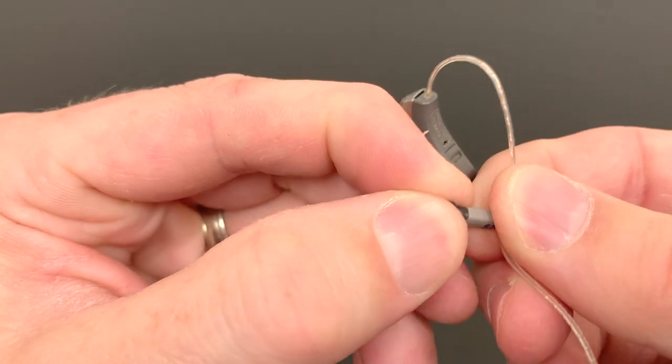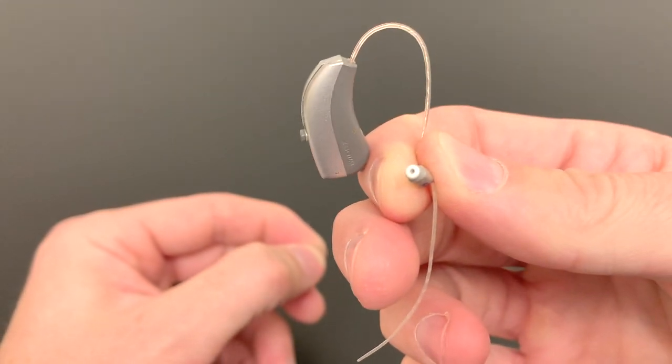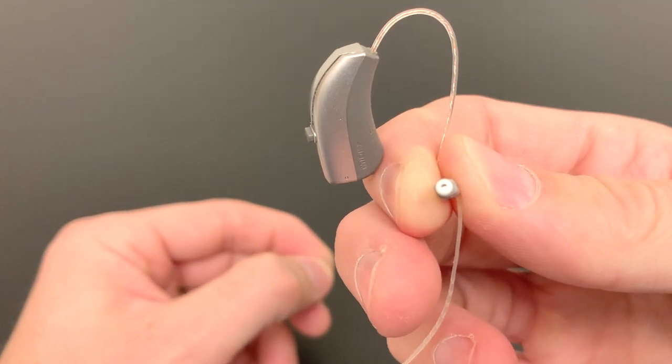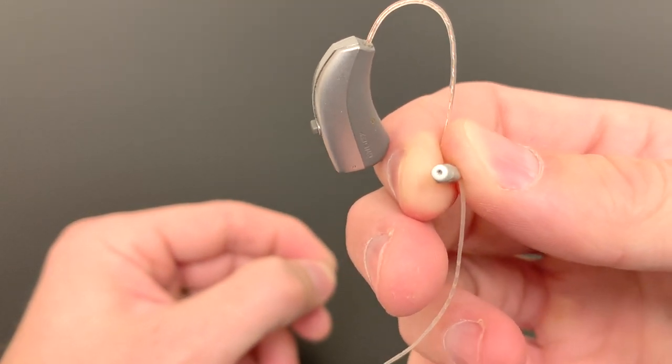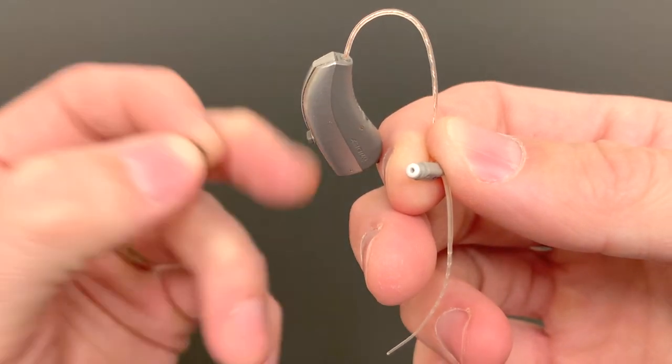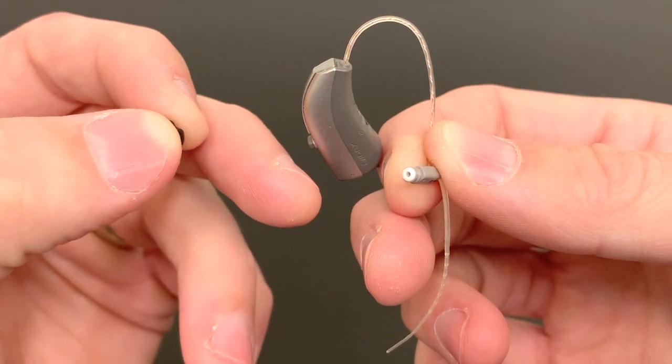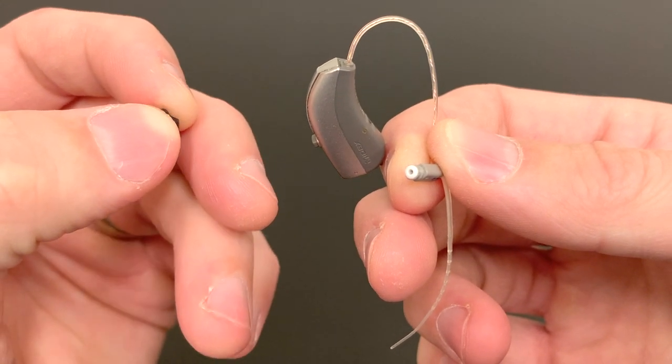And underneath the dome, if you squeeze and pull, is what we call a wax guard. Now, the wax guard is the number one reason why we get a phone call about my hearing aid's not working. That gets plugged up with ear wax at times. And in another video, I'm going to show you how to change that and keep it clean.